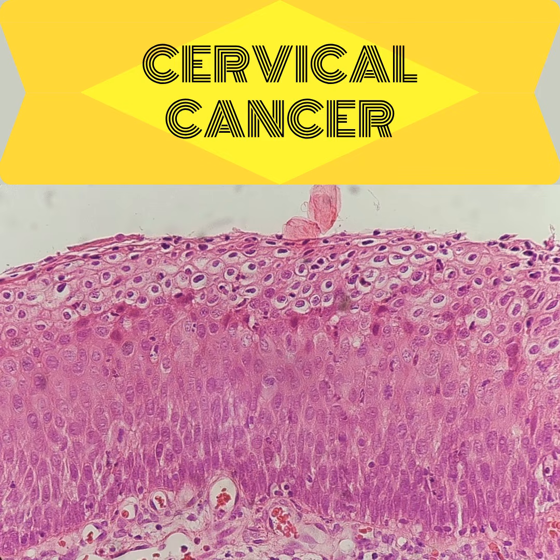The histopathological assessment of this cervical transformation zone specimen demonstrates a classic high-grade squamous intraepithelial lesion, specifically staged as cervical intraepithelial neoplasia grade 3, which is defined by the expansion of immature dysplastic cells across the entire thickness of the epithelium. The normal orderly maturation sequence from the cuboidal basal layer to the flattened glycogenated superficial squames is completely obliterated and replaced by a monotonous population of basaloid cells with scant cytoplasm and indistinct borders.